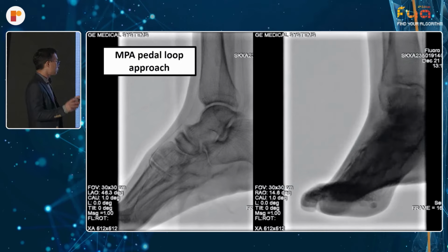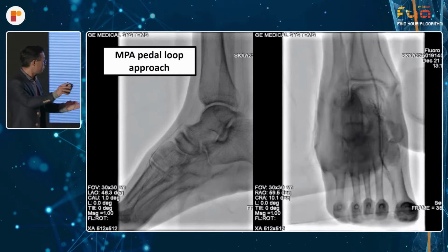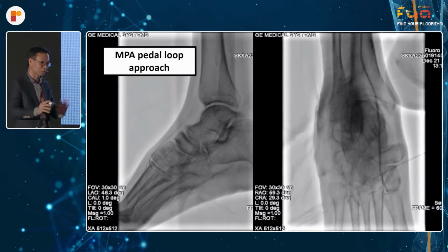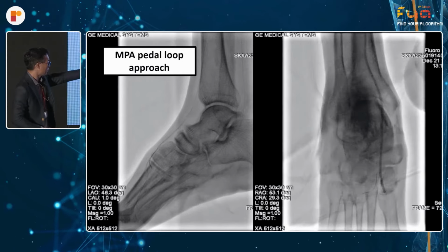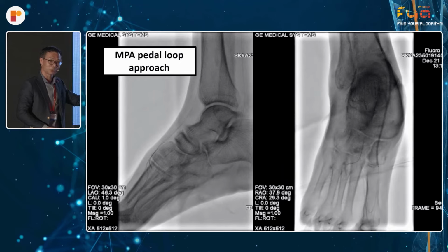August has got a really nice picture in your LinkedIn profile. It looks like when you go around the medial plantar loop, it looks like a heart shape. It's very, very romantic. So this is in a craniocaudal projection.